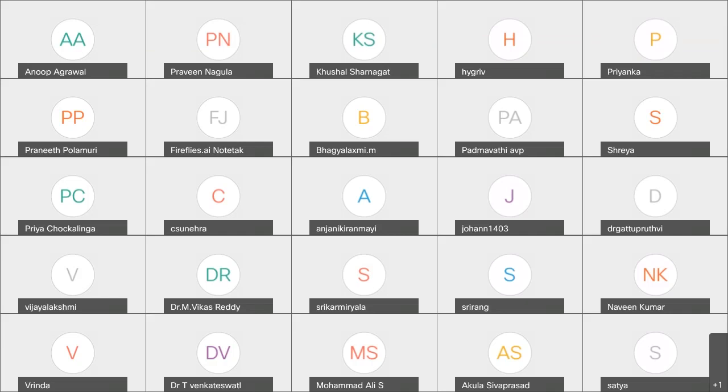And not only the presence of the gadolinium, but now we have moved to a stage where we're able to quantify it. And the quantification seems to be making the difference, because the earlier studies where presence or absence of gadolinium were used had no relevance to mortality. But once we started quantitating, we came to this figure of 15%, that once you cross this threshold, the chance of sudden cardiac death almost doubled. So I think we're moving towards a more quantitative parametric approach, both in terms of late gadolinium enhancement and T1 mapping, which is going to make us even better in helping us stratify these patients. Not the perfect tool, but it will be one of the important tools.